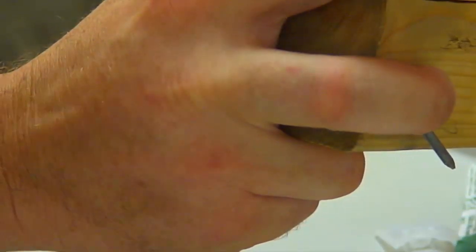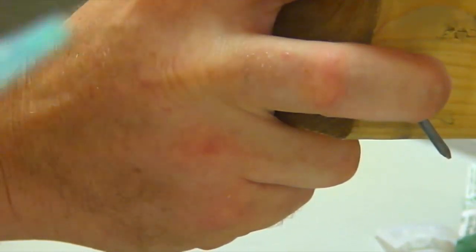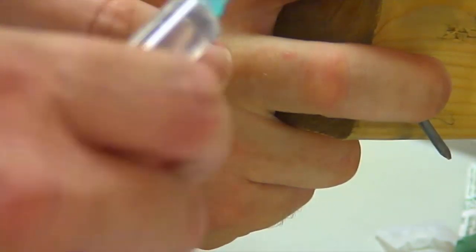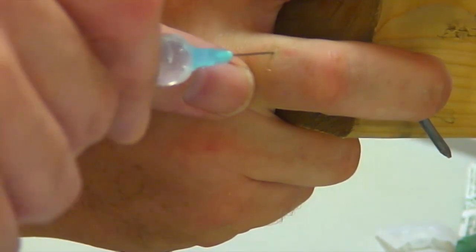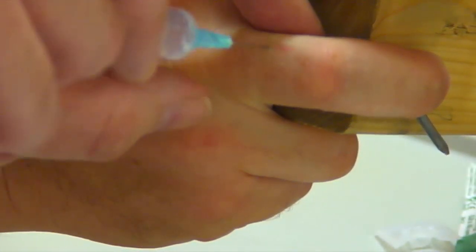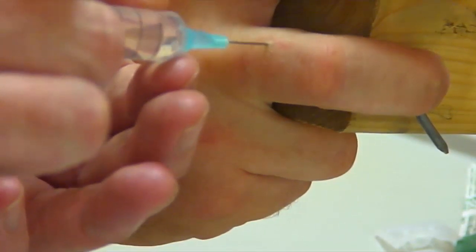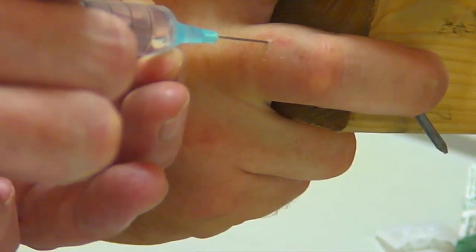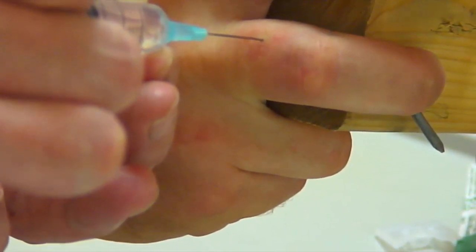We are now going to give the ring block. To do this, we clean the skin over the area and warn the patient that this is going to sting for half a minute or so to start with as we put the anesthetic in, a bit like a blood test. We put in the needle just to the side of the bone, aspirate to check we're not in a vessel, and then inject. I'm giving 2% lignocaine — 1 to 1.5 mils on each side of the finger.